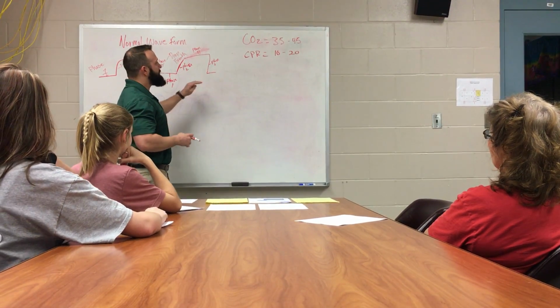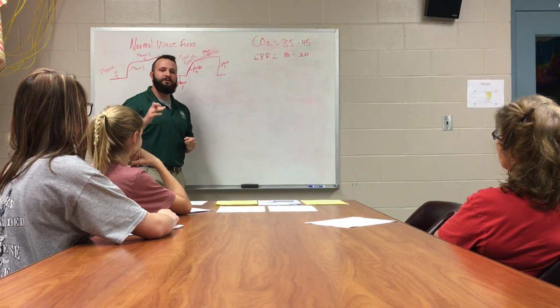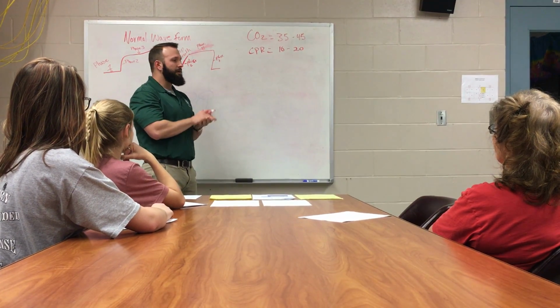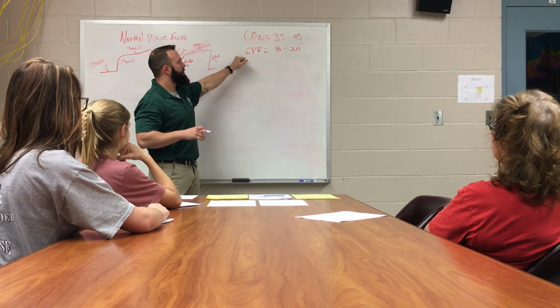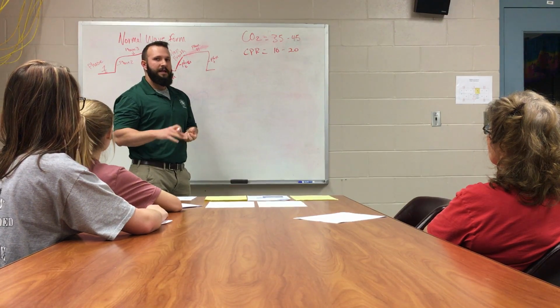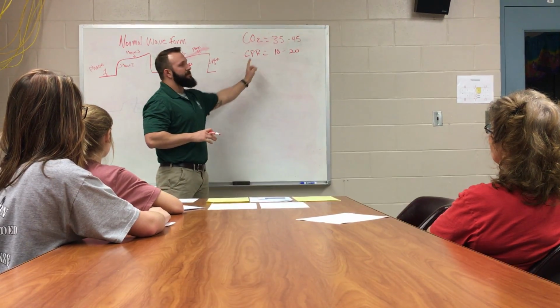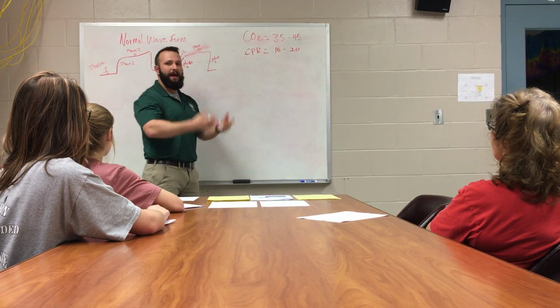How can end-tidal capnography benefit the patient in cardiac arrest? It can measure our compression rate. It can let us know if our compressions are doing the best that we can do for the patient, because it's going to allow us to measure the CO2 exchange. If I'm compressing your chest enough, I should be compressing your heart enough to move blood into your lungs. We ventilate. Your lungs then exchange gases because I'm moving your heart for you. I should be able to measure that with my end-tidal capnography. It's going to measure the CO2 that's coming out of you.